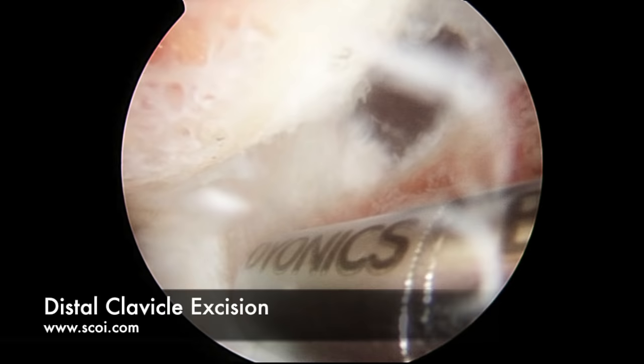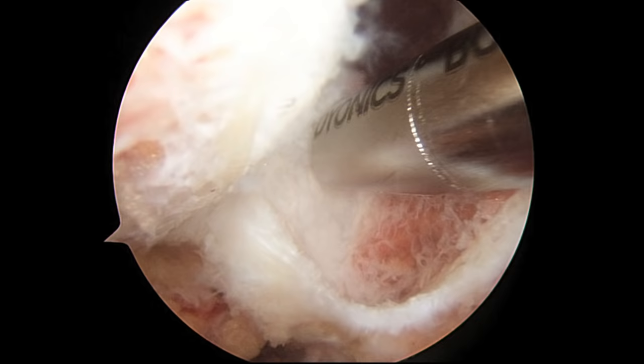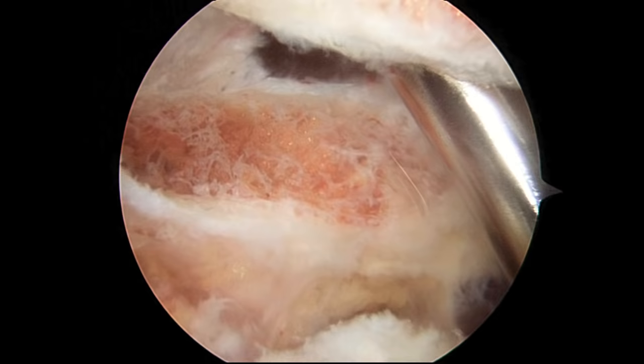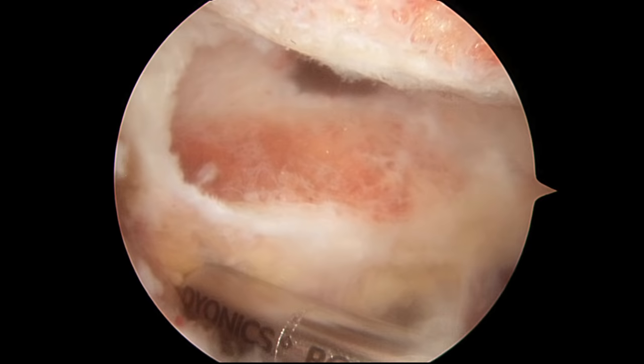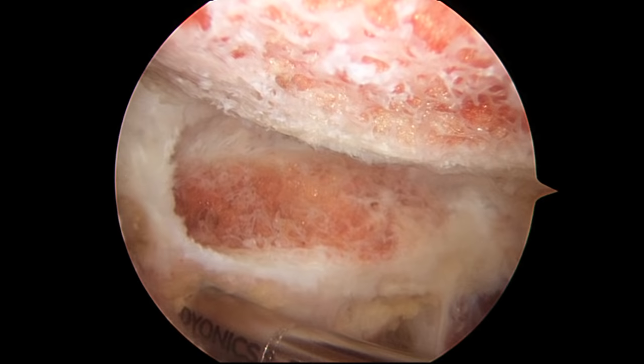We'll try to leave these ligaments here intact. Now we've completed the excision of the distal clavicle — we've got plenty of room in here now. We pull back and can look at the collarbone end-on. That's an appropriate resection. We'll get this patient to the recovery room and hopefully have a quick accelerated recovery. That's a diagnostic shoulder arthroscopy, rotator cuff debridement, subacromial decompression, and distal clavicle excision.